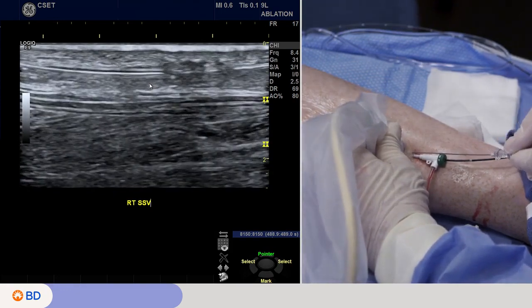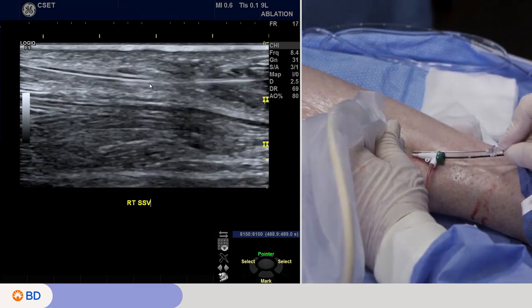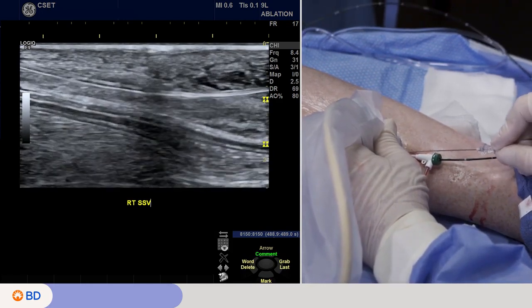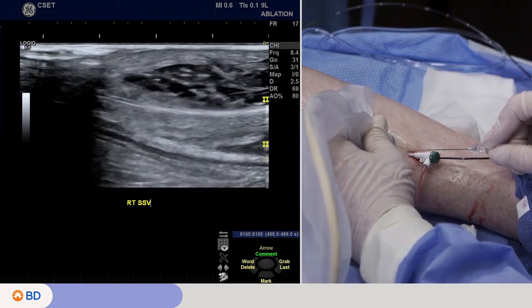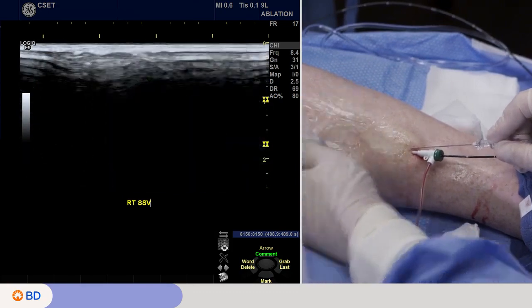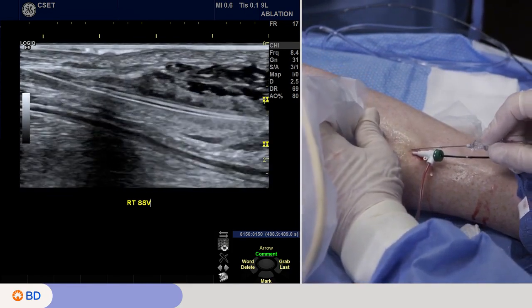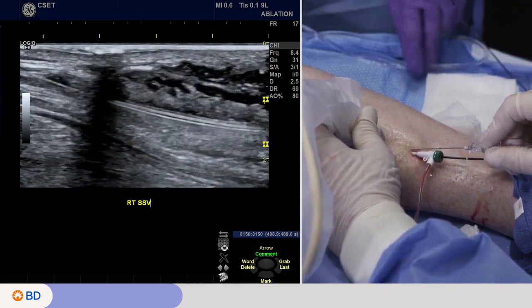I'm putting my ultrasound probe in the sagittal view, laying out the catheter and the vein. And you can see as I'm working through here with the pedal administering the tumescence, which shows up black on the ultrasound. The fluid, the water in it, will be very echolucent, so it's dark. You can see me pushing down the vein and pushing it away from the skin. We want to keep a safety distance all the way through the treatment away from the skin of at least 5 millimeters. I'm sorry, at least a centimeter.